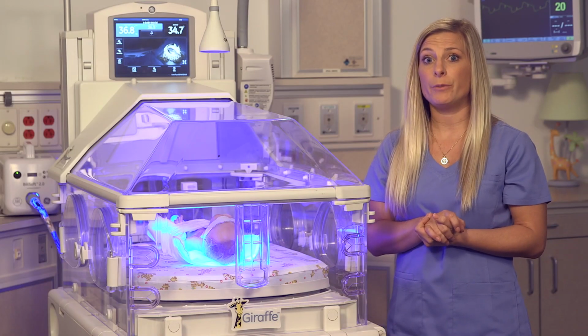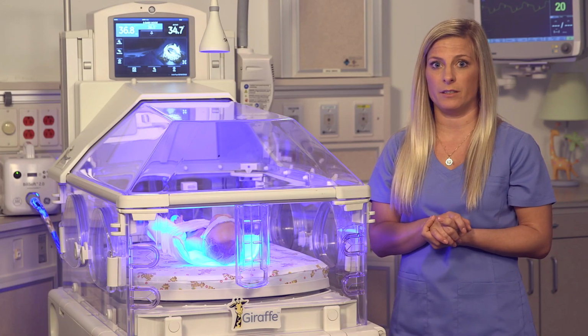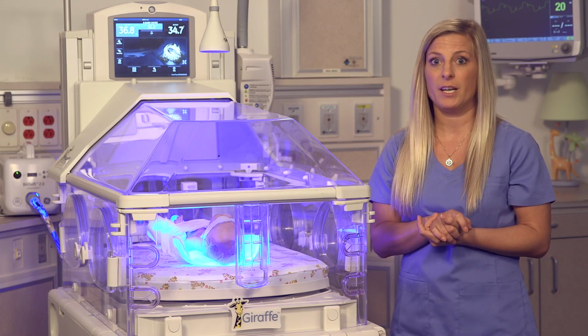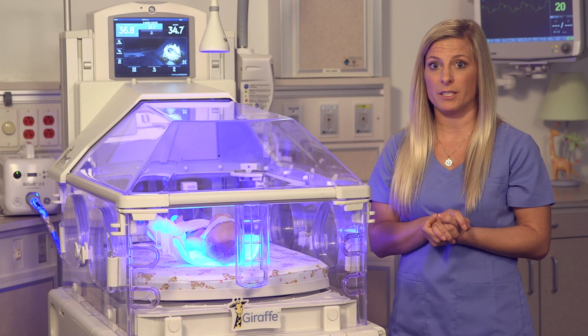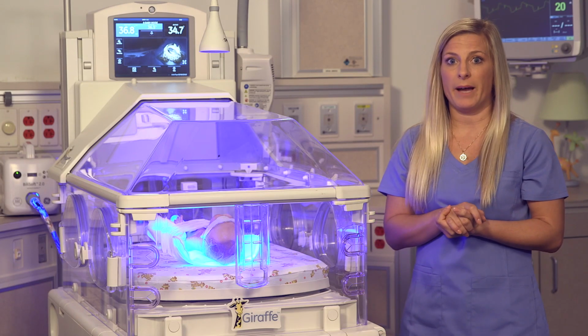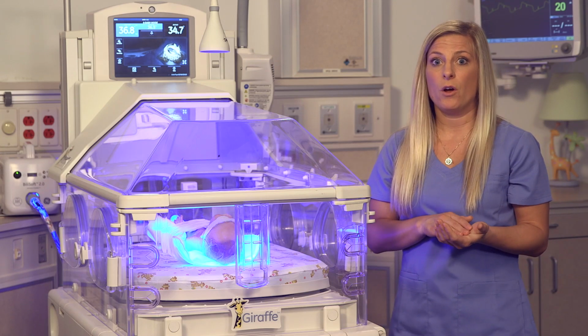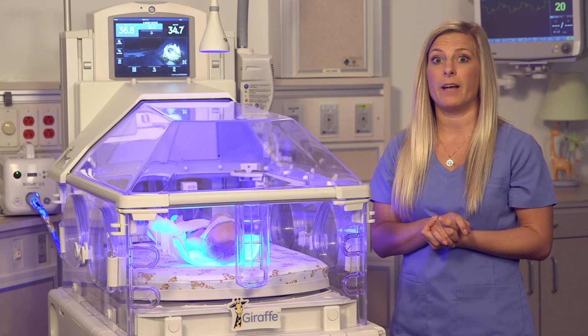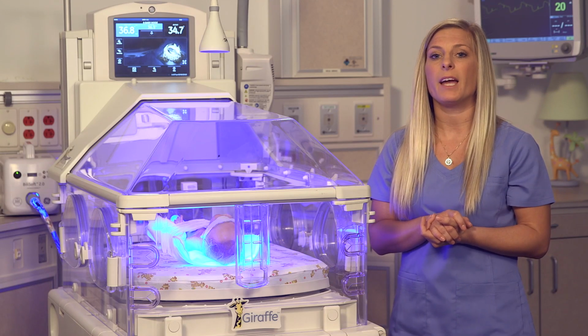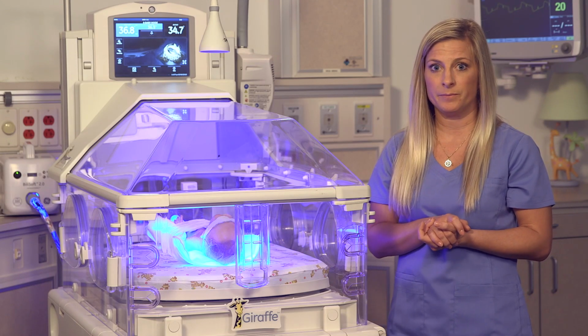Just remember, when you're doing this, make sure to keep the meter still. Do not subject the BiliBlanket Meter 2 to shocks or vibration, especially at the time of zero level adjustment. Inaccurate readings may result. You'll need to install new batteries if the display window is blank or a battery mark will appear above the measured value. If you continue to use the instrument, the mark will start to blink and measurement will no longer be possible.